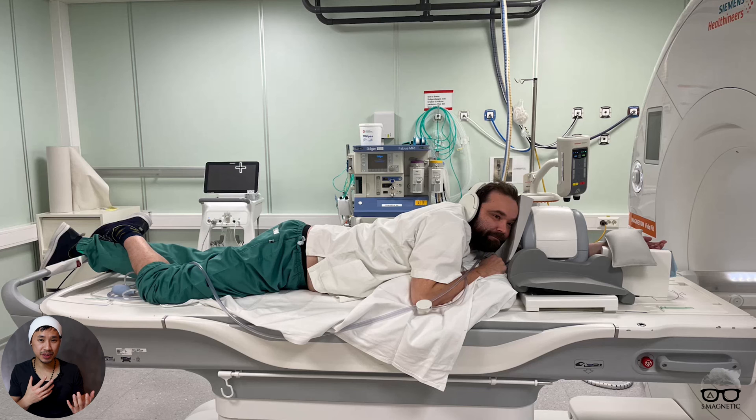Starting with the least comfortable: the superman position in a knee coil. I've tried it myself — you get very good images, but the patient needs to lie uncomfortably. You can put a pillow down to lift the legs a little, but you feel like you have to stretch your arm too much and there's no good position for your head. You can lie a little to the side, but then your arm is just stretching out — it's not for everyone. I rate this as the least comfortable position, though you do get very good images if the patient can manage it.